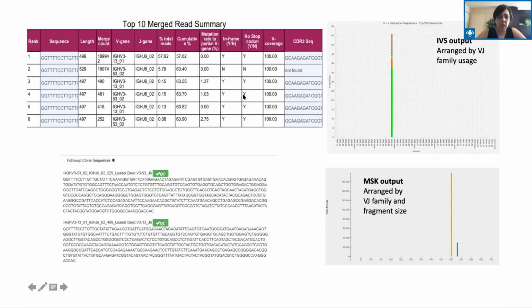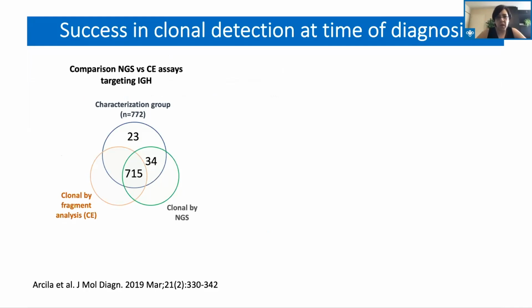Every time that we sequence a sample, the very first time to diagnose the clone that we're going to track, we do specific QC checks so that we make sure that clone is unique to the patient. So what you see here, for example, with the QC in green, is the fact that we have actually looked at every single patient sample that we have done in the past and ensure that no other patient has this type of clone as part of our QC checks every time that we do.